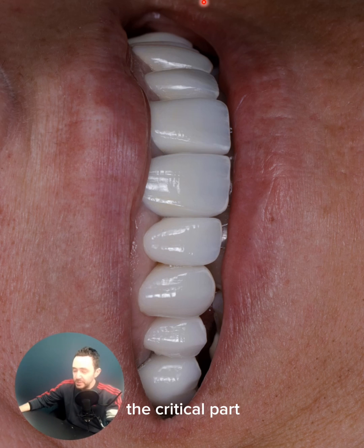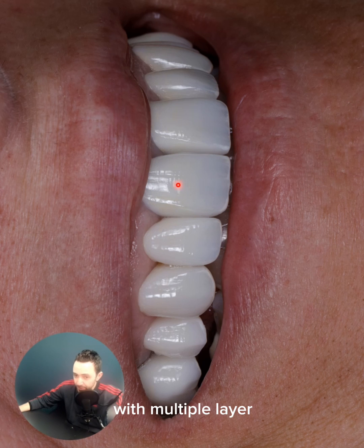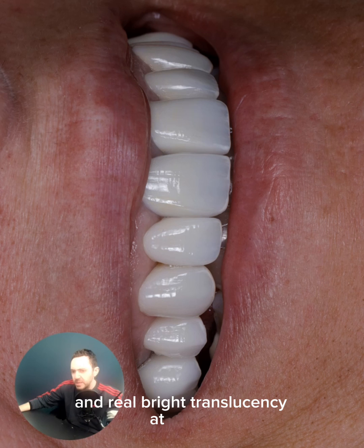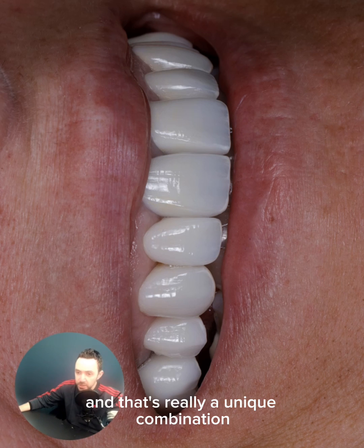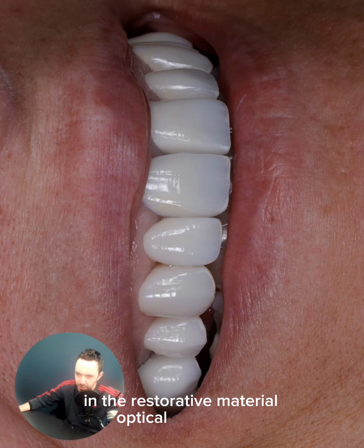Usually the critical part in developing any restorative material with multiple layers is the transition layer. What you see here is effective masking ability at the cervical and real bright translucency at the incisal — and that's a unique combination in restorative material optical properties.